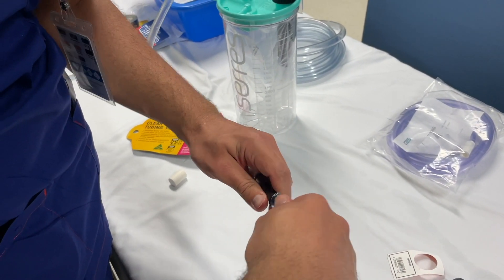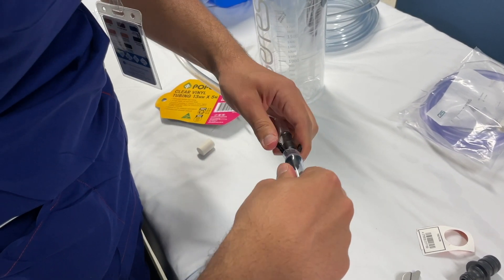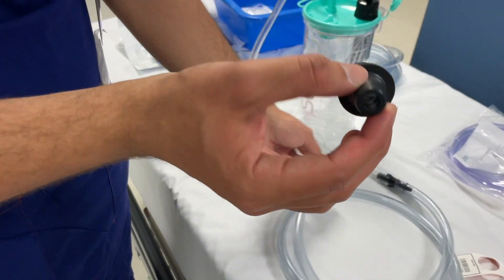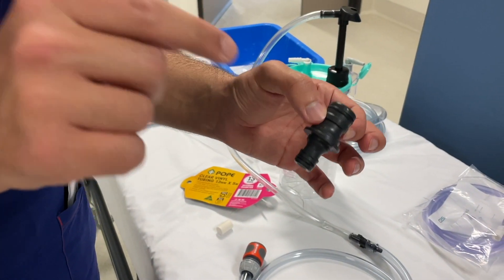And we now connect this end of the tubing with our pump, because this pump will then pump the salad fluid into the mannequin. And the cool thing about these Gardena connectors is that this one actually fits into the esophagus of the salad mannequin.